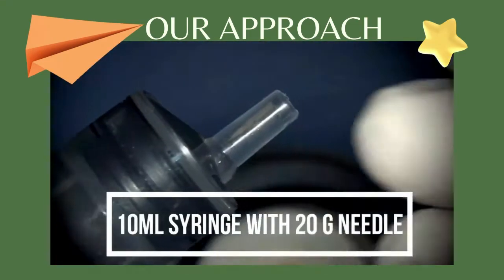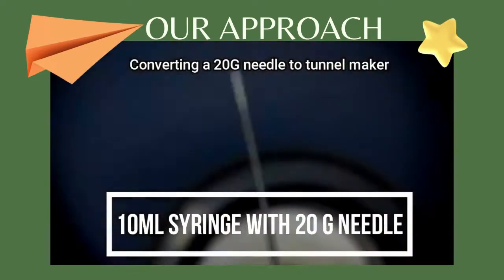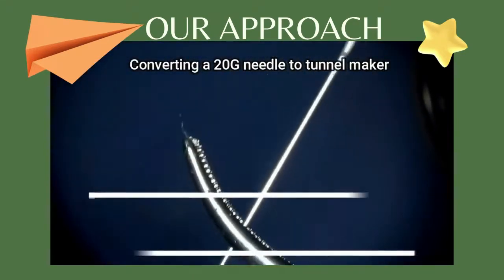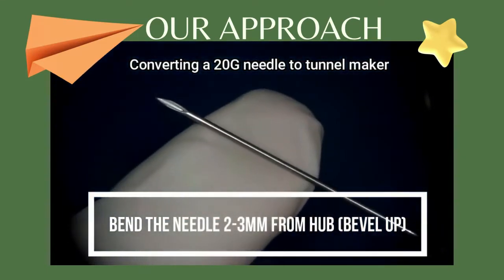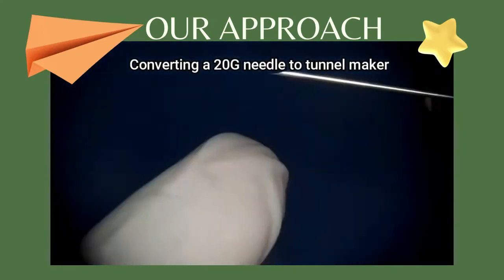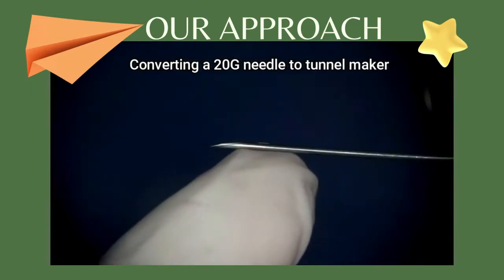We use the needle which comes along with a 10 ml syringe, which is approximately 20 gauge. We call it the HTM, or the haptic tunnel maker. This needle is then bent 60 to 70 degrees at its hub with the bevel end up. This angulation not only helps with the maneuver, but also makes the procedure safe, as the needle travels tangentially along the scleral plane rather than in the angulation, hence preventing a full thickness penetration.